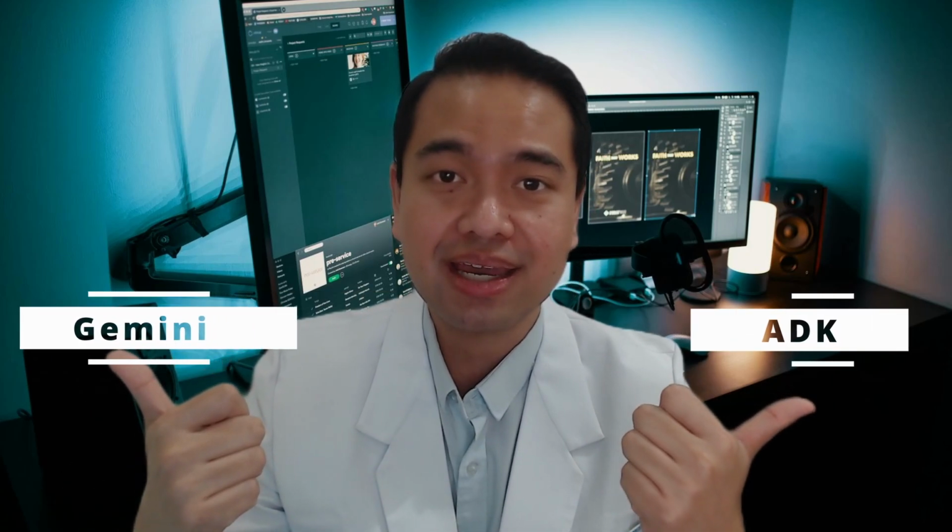So I believe that given a little more time and effort, I could have added more agents to my workflow, given them more tools to use, more functionality, more complexity. But this project is not a testament of complexity. It is a testament to possibility, to sheer potential and viability. The fact that a person like myself was able to build and learn this in just under 2 weeks with the help of Google Gemini and Google ADK opens an entire world of opportunity.